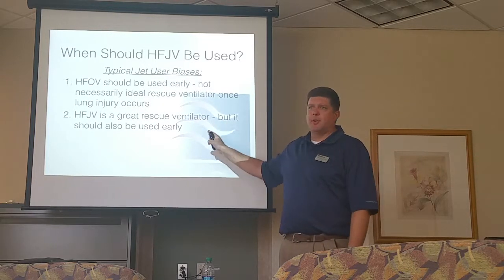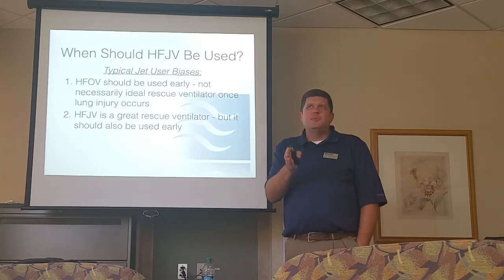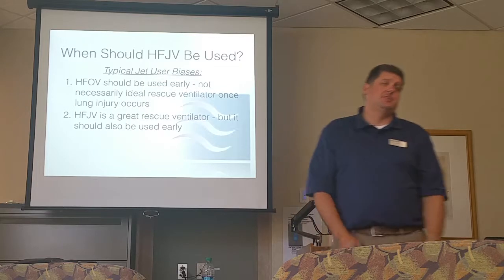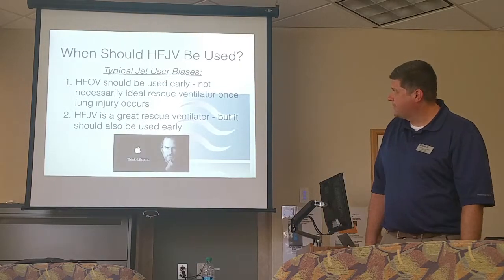It can be used earlier, it should be used earlier, and if we use it earlier, then we're not using crazy pressures and crazy strategies to try to save this kid. We're in more control of the situation, and that always works out better for everybody.